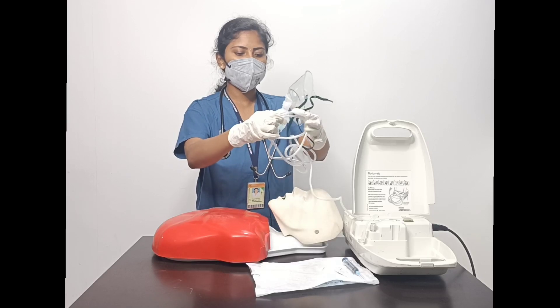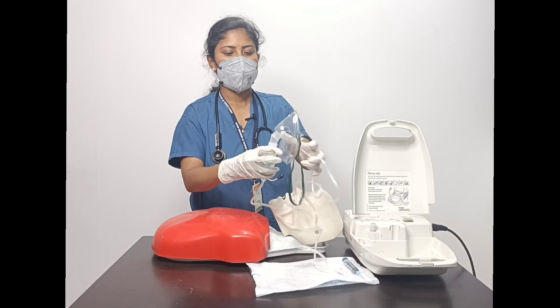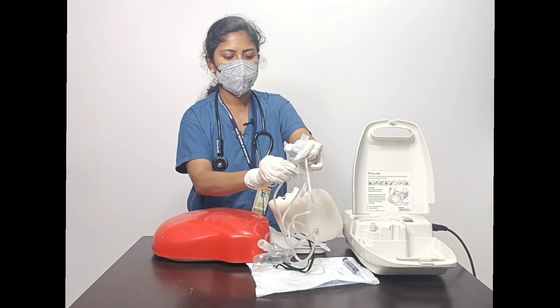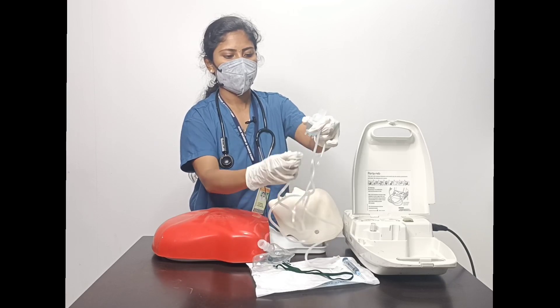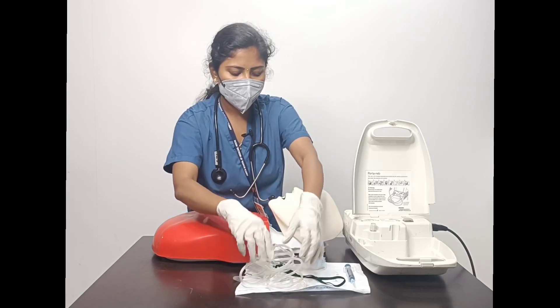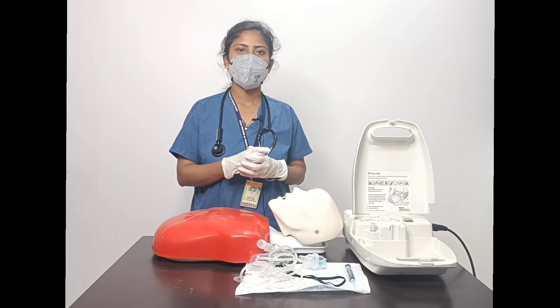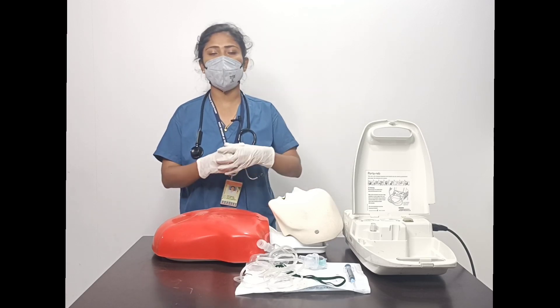After nebulization is complete, provide the nebulization kit to the patient if needed, then disconnect every part of the equipment. Clean all the parts with warm water or a spirit swab, then allow them to dry.